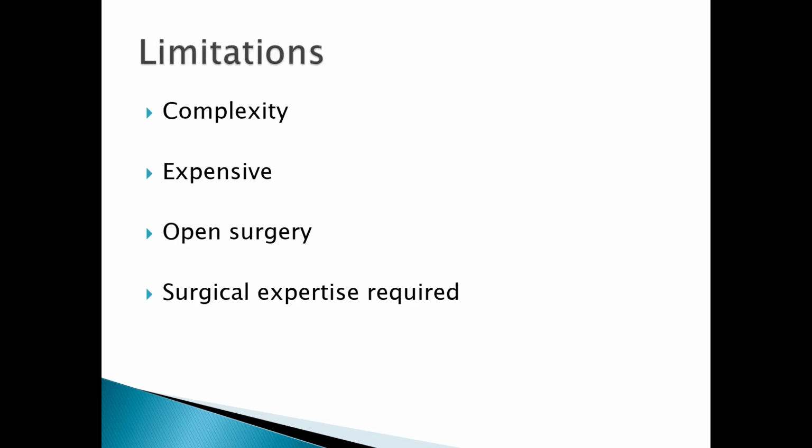Next slide. So what are the limitations of this ventricular assist device? One of the limitations is that it's quite complex. Most of the machines are too complex to use. It's expensive. And most of them require open heart surgery, where you open the patient and insert the machine for further use. And also surgical expertise is required. So these are the limitations of these ventricular assist devices.